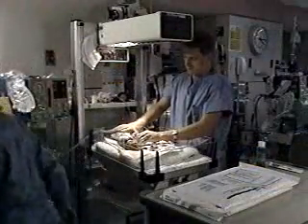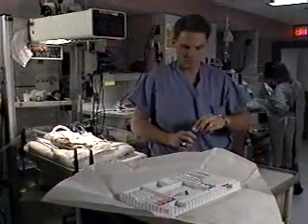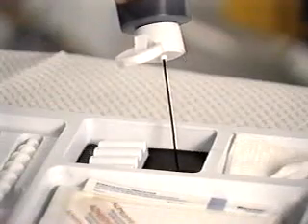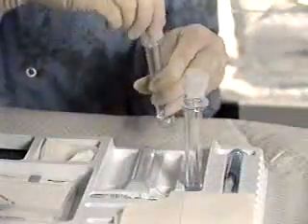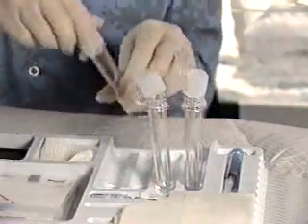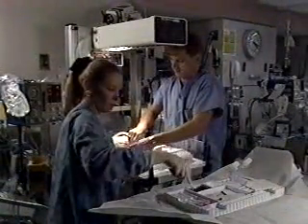Once the clinical status of the neonate is assessed and monitors are in place, the assistant prepares the equipment. The assistant places the sterile spinal needle onto the tray and pours betadine solution into the well. He then returns to the bedside to position the patient in the lateral decubitus position. The practitioner, wearing sterile gloves, sets up the 3 tubes, checks the spinal needle for ease of withdrawal of the stylet, and positions herself at the bedside.